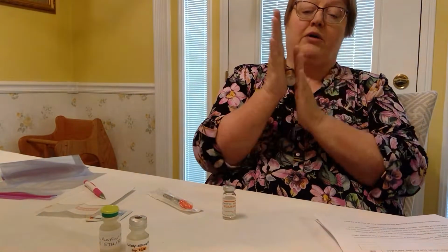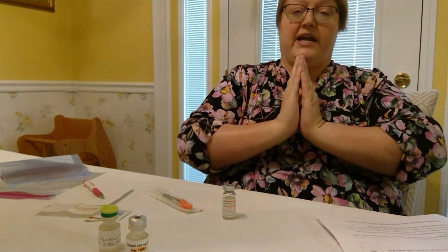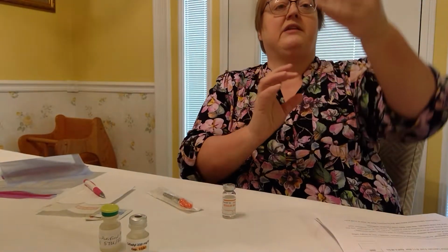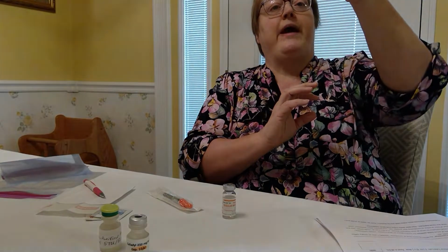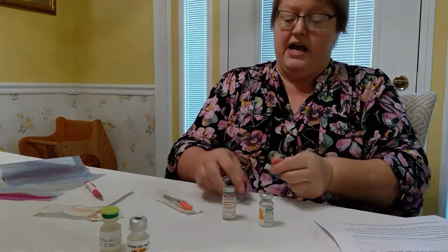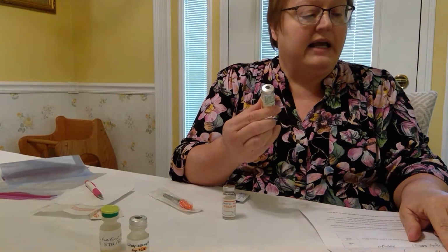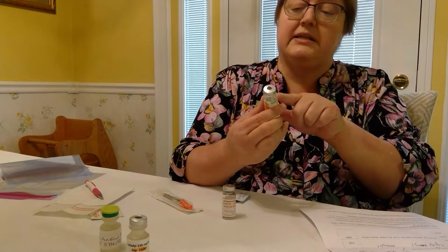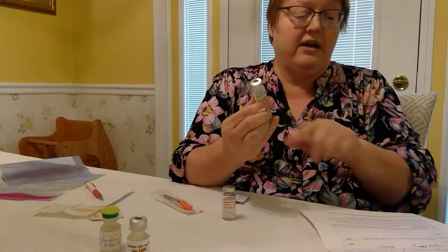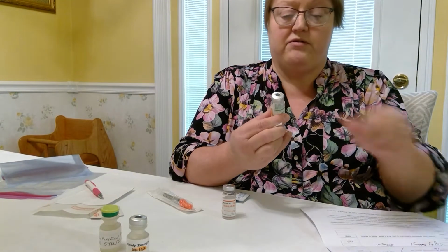First, I'm going to rotate. Do not shake vigorously, but rotate my NPH so that I can tell that everything is cloudy throughout, no sediment at the bottom. I'm going to check one more time, insulin, NPH. I'm going to give 32 units. There's plenty here. Sub-Q at this time to Miss Frozen.